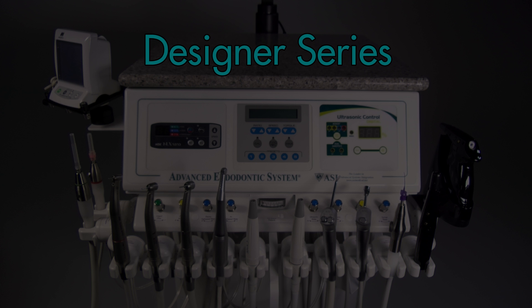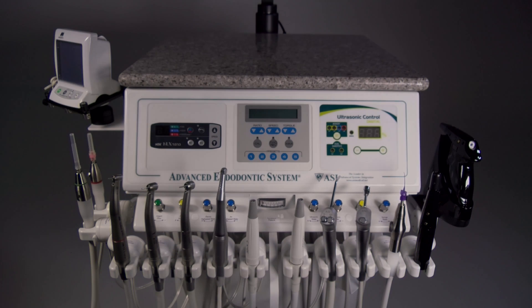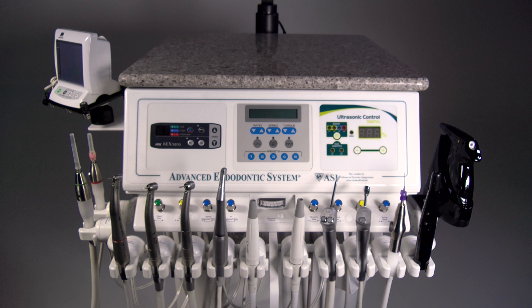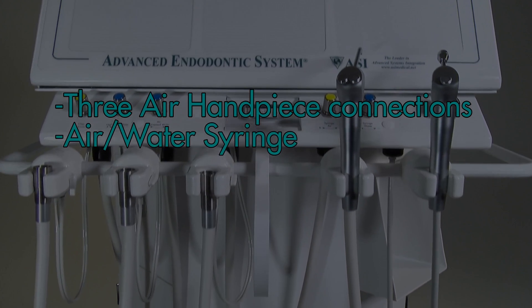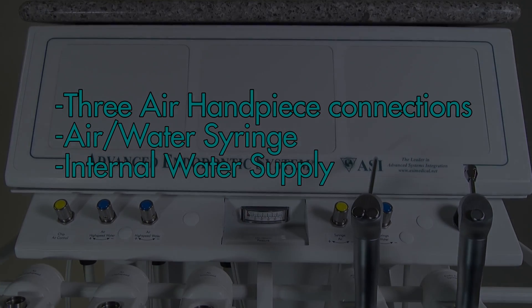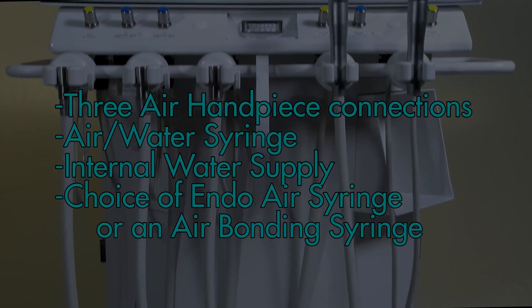ASI's Designer Series of our Advanced System line features many unique capabilities, combined with the high-quality features that our customers want. The Designer Series is a fully functioning dental delivery system with three air handpiece connections, air water syringe, internal water supply, and choice of an endo air syringe or an air bonding syringe.